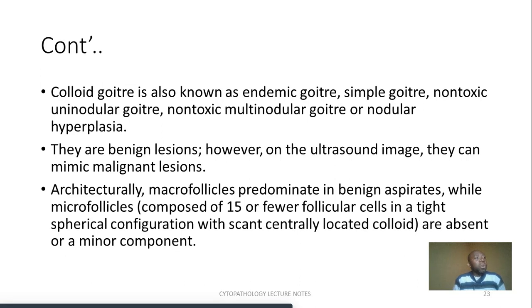So when we talk about colloid background, it is very common. It's not that it only appears in goiter cases or in thyroid cytology, but it can appear anywhere, though it is very prominent in thyroid cytology, where goiter falls.